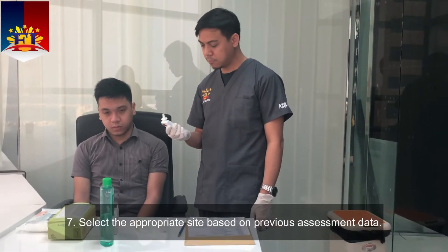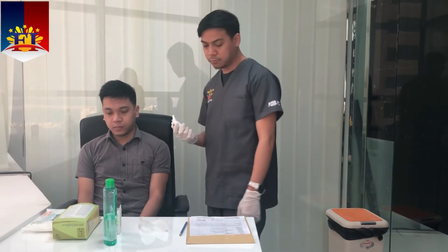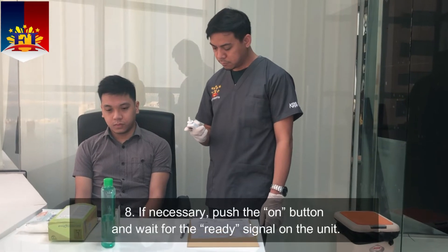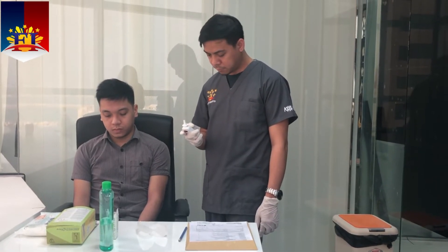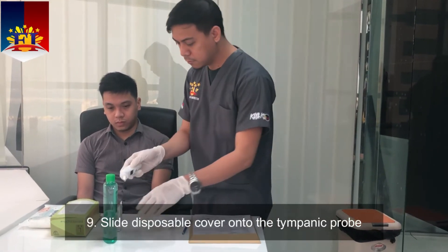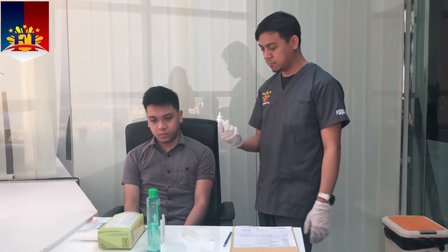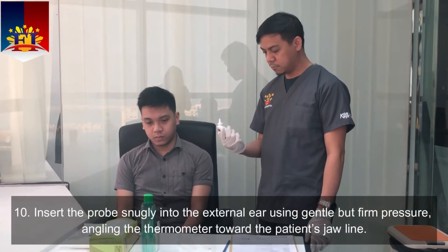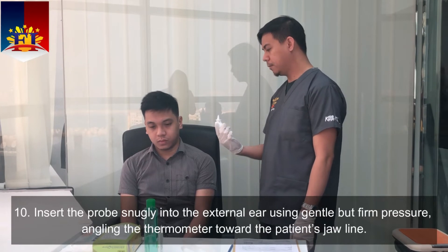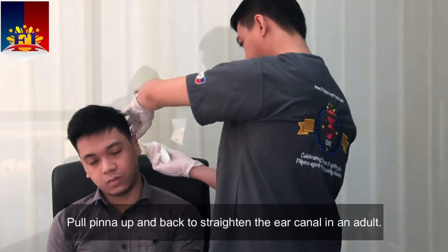Select the appropriate site based on previous assessment data. If necessary, push the on button and wait for the ready signal on the unit. Slide the disposable cover onto the tympanic probe. Insert the probe snugly into the external ear using gentle but firm pressure, angling the thermometer toward the patient's jawline. Pull the pinna up and back to straighten the ear canal in an adult.